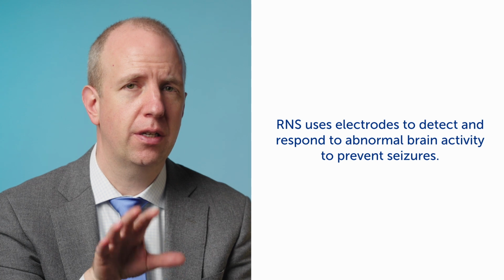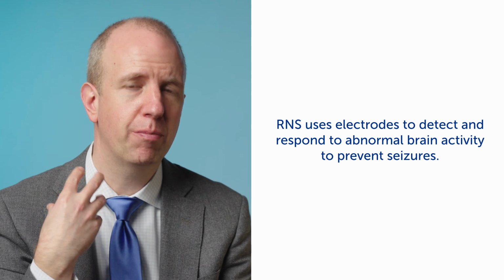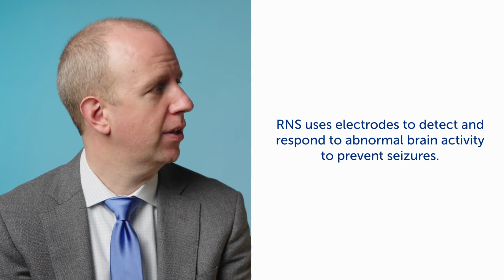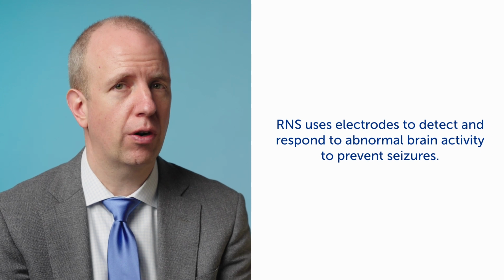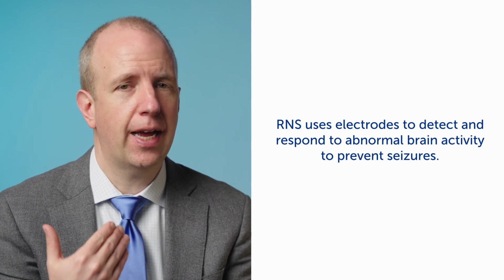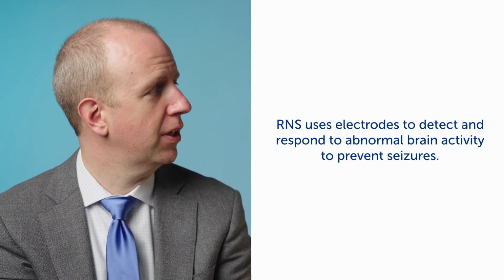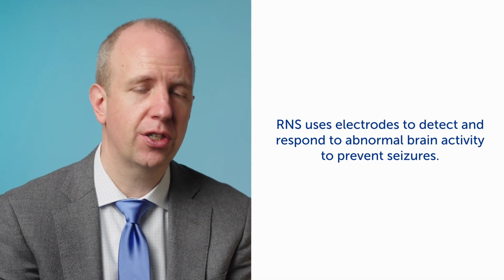Responsive neurostimulation is actually a fairly new treatment, and it's another treatment similar to a pacemaker for the brain, where electrodes are implanted on the brain and connected to a device which includes some electronics and a battery implanted actually on the skull in this case. And it's a device that has some unique capabilities. It can actually record from the brain and transmit that information wirelessly to our neurology colleagues. And it actually is able to understand that and deliver a therapeutic stimulation in response to what it records when programmed to do so by us as clinicians.